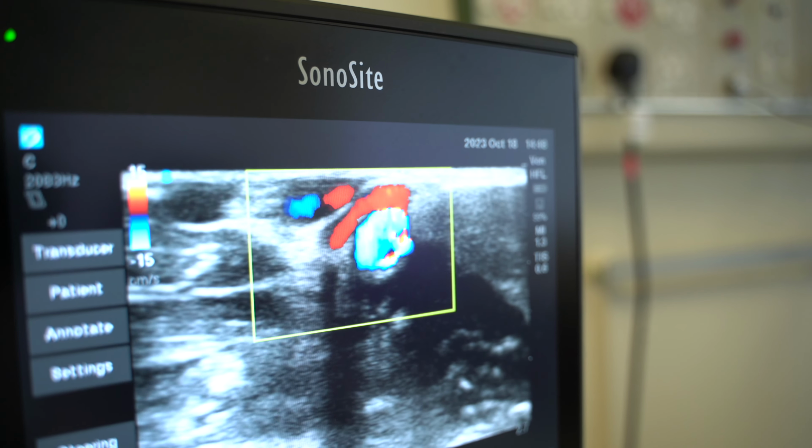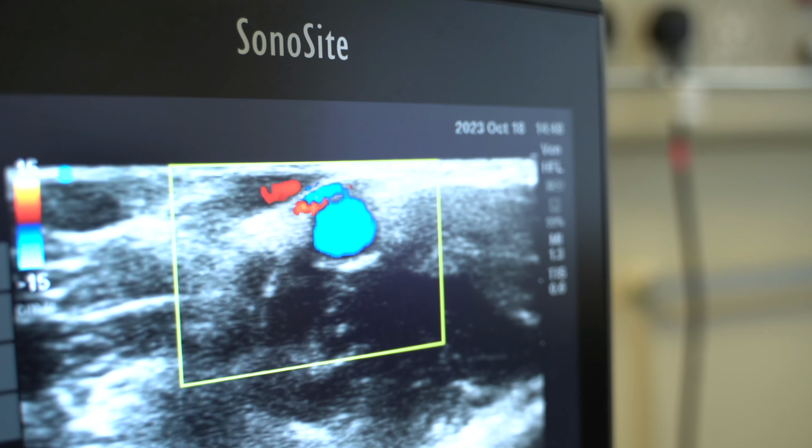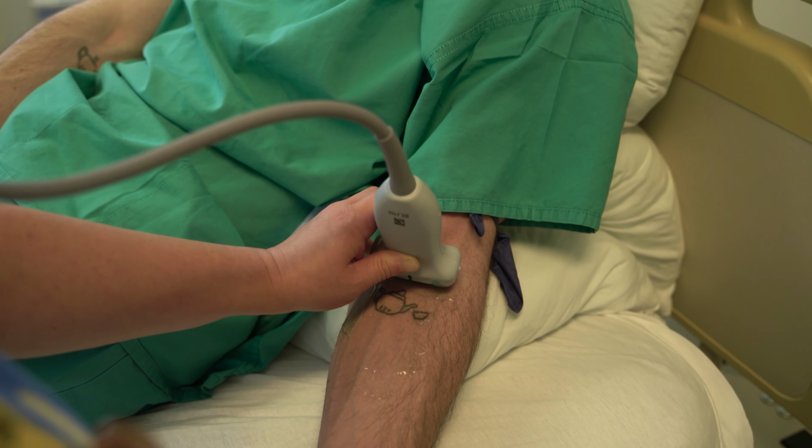What does this mean for us when we do ultrasound? The Doppler setting on the ultrasound machine lets us characterize blood flow, where the flow towards or away from the probe is displayed as a pulsing red or blue color superimposed on the ultrasound image. It also helps us differentiate vascular from non-vascular structures.